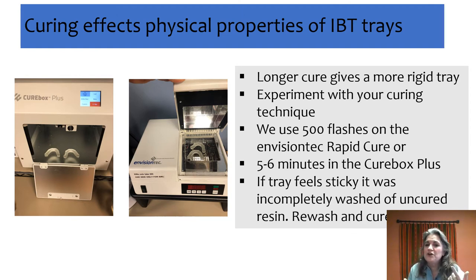The longer you cure it, the more rigid it will become. For us, using our EnvisionTech RapidCure, we go 500 flashes — compared to 1,000 on each side when doing a model, so it's about 25% of the cure time you might use for a model. If we're using our Cure Box Plus, we leave it in for about five to six minutes.